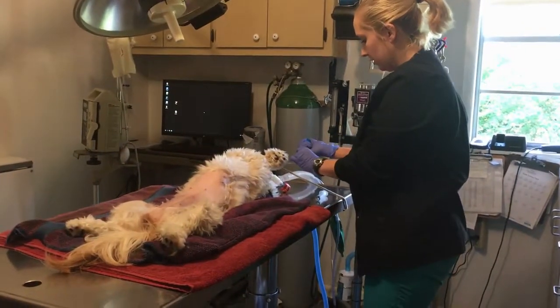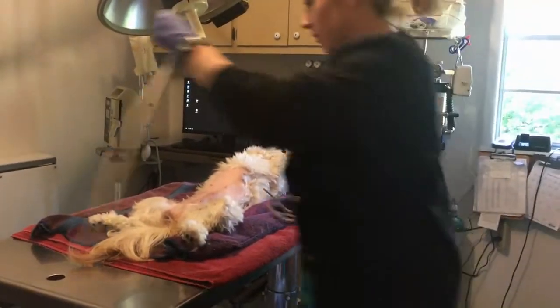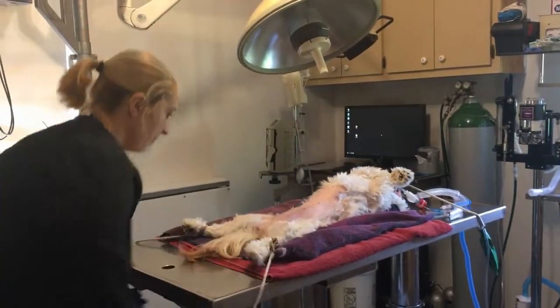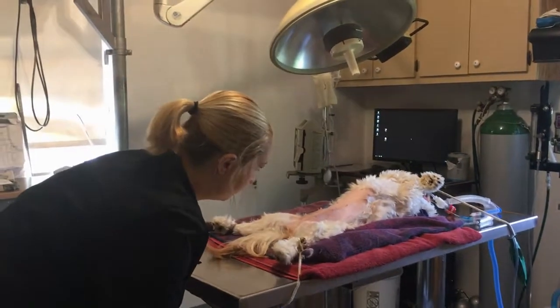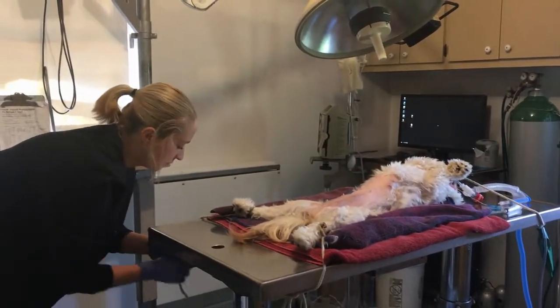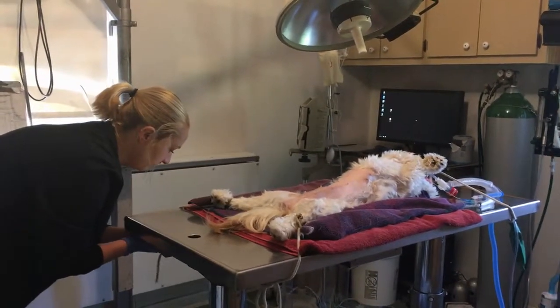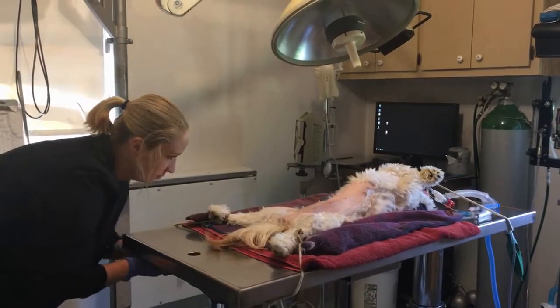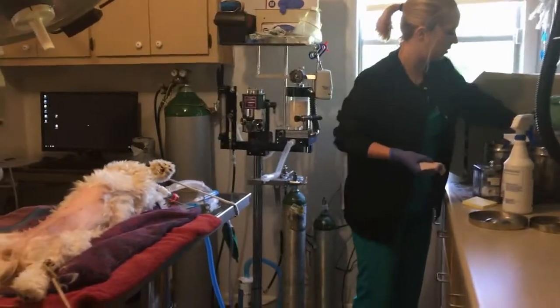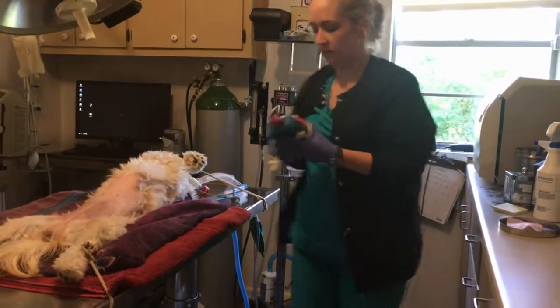Re-inflate her cuff. We'll go ahead and attach her to our pulse oximeter.